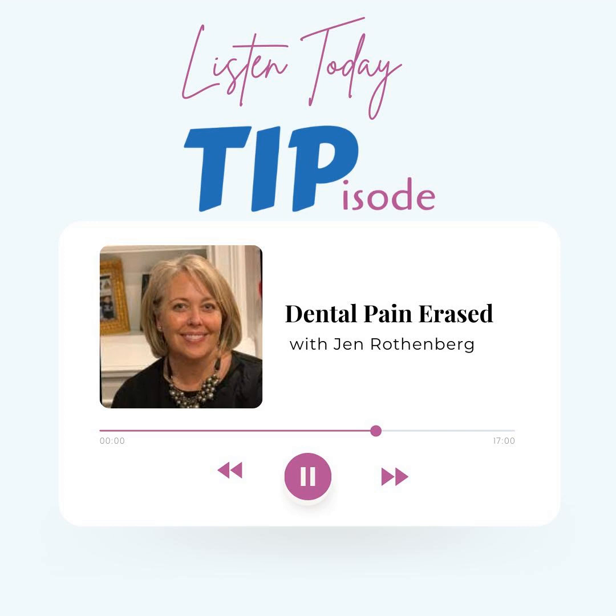Right in the center is your on button. You turn it on, and at the tip, the light will turn blue, and then you know that these tips are ready to use. You can just touch it after you turn it on. It's not going to shock you. There's no danger to any of this. It's only 10 kilohertz. But again, how many nerve endings do we have?